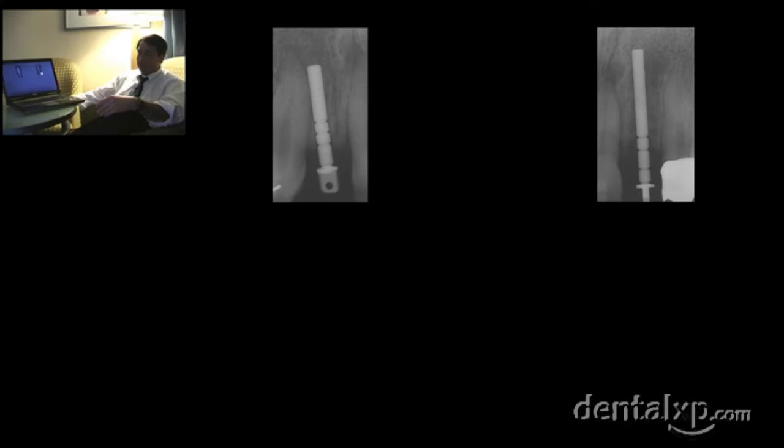In my experience, one of the most difficult implants to place is the single lateral incisor, because as an operator it's very easy to think that you're going parallel to the root surface, but especially for a right-handed operator you tend to angle that implant back towards you. So I'll take the check x-ray, and I'm often very surprised that my implant is not where I think it is. So what we'll do is straighten out the implant, and now we've placed it parallel to the roots.